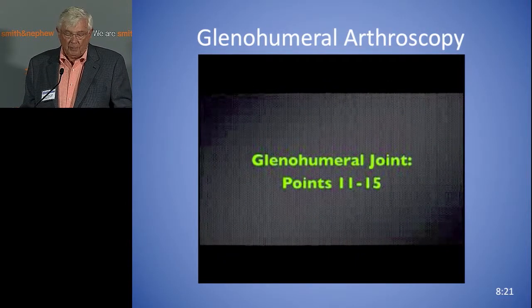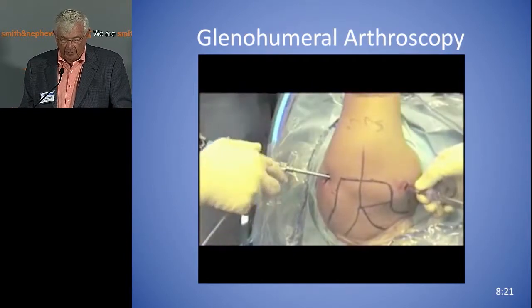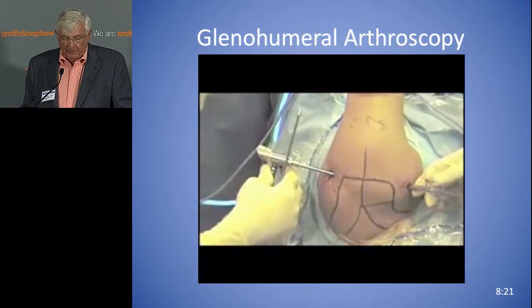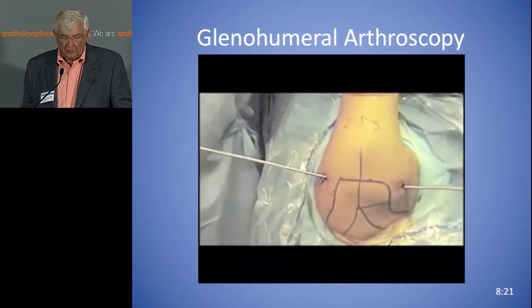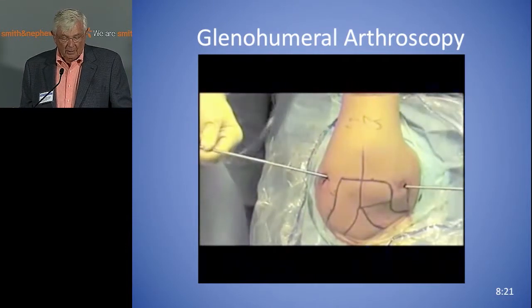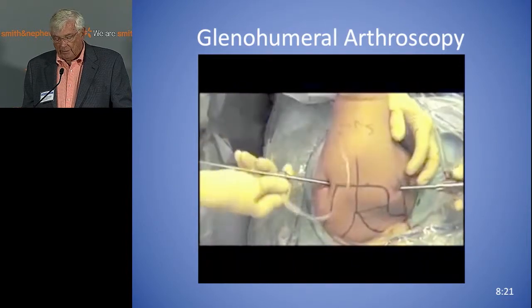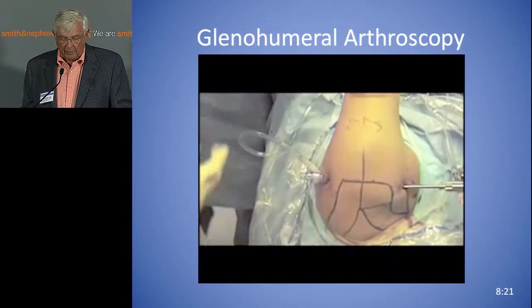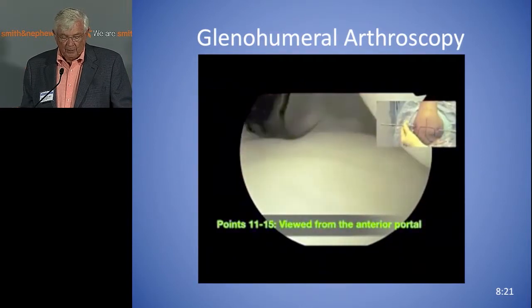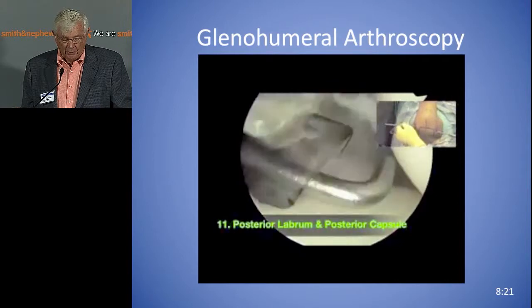Okay, now we'll move to looking from the front. I think you need to really get used to doing this if that's not your forte. And then eventually we'll talk about instability surgery from the front. I've used Smith and Nephew cannulas for the last 25 years that you could very easily switch from the front to the back in under 10 seconds. Otherwise you can use the switching stick method. We finally got the scope in the front, and now we're looking directly in the back — oriented with the floor, since I'm a lateral-position person.